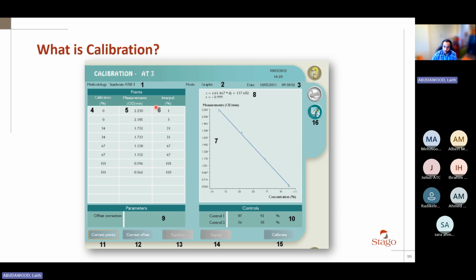I don't mean 10% like this is 11%, okay, this is acceptable. No. 10% difference. For example, what is 10% difference here? It's around 3 points difference only, not 40%, 41%. This is not what I meant, okay? 10% difference means 31 minus 34 divided by 34, that will give you a value of percentage difference, okay?